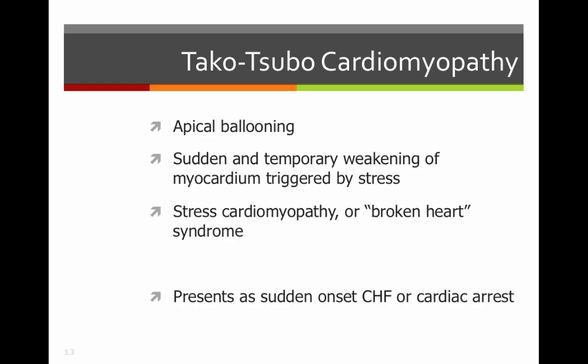This is an apical ballooning of the left ventricle, so there's a very sudden and temporary weakening and stressing of that left ventricular wall, usually triggered by stress. This is what we call the broken heart syndrome. If you've ever heard of that, people actually do die of broken heart.